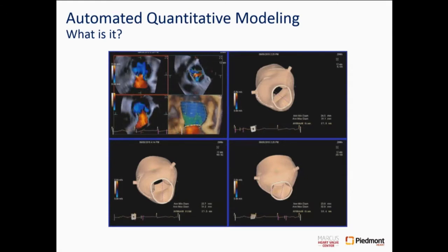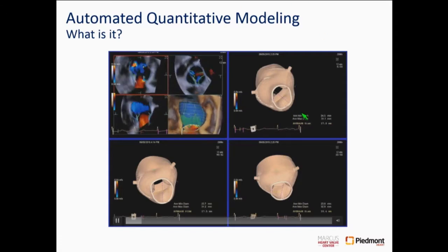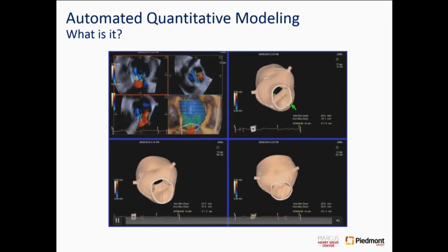This is again a completely automated measure, just like CT would do. One would measure minimum and maximum diameters and an average diameter, which would be the mean diameter. You can also get perimeter derived and area derived diameters, just like CT.